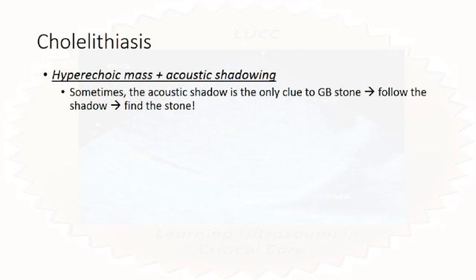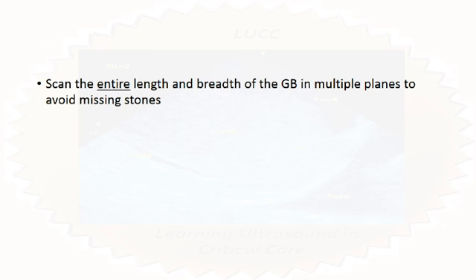Now, the important thing is you have to scan the entire length and breadth of the gallbladder in multiple planes in order to make sure that you don't miss a stone. This is an example of a gallbladder stone.